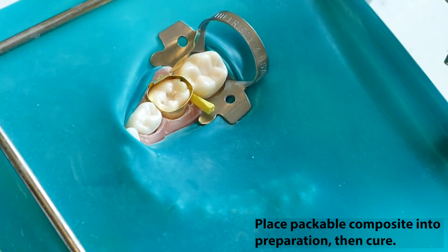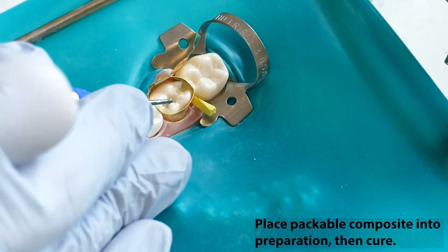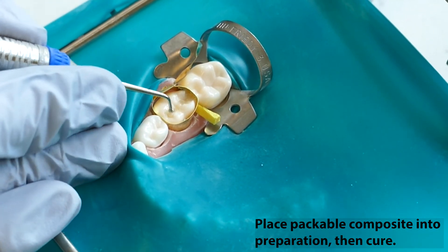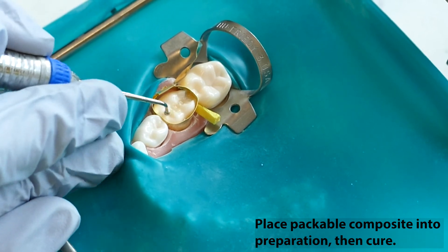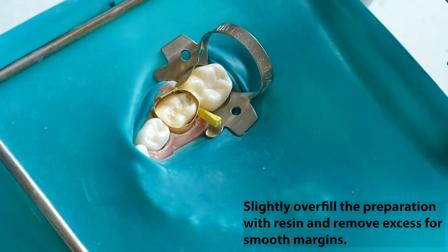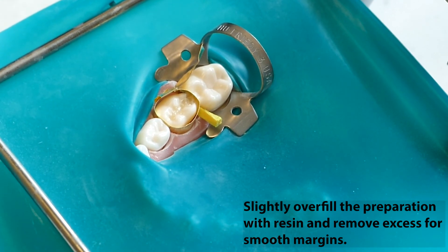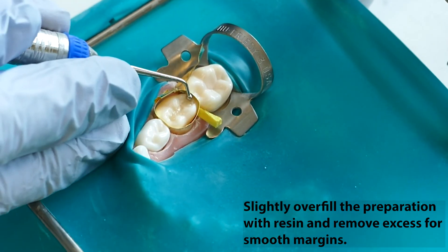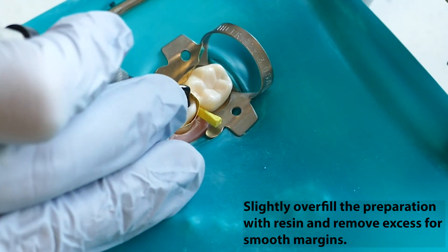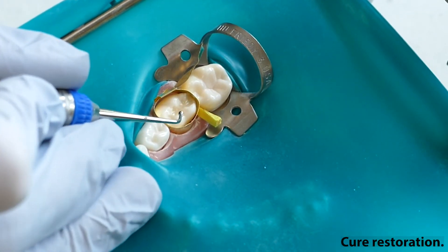Place packable composite into the preparation, then condense the composite into the preparation with the appropriate instrument. For primary teeth, composite may be placed and cured in a single increment. Slightly overfill the preparation with material and use a ball burnisher to push the material towards and up and over the enamel margins. Once all excess material has been removed, cure for 20 seconds.